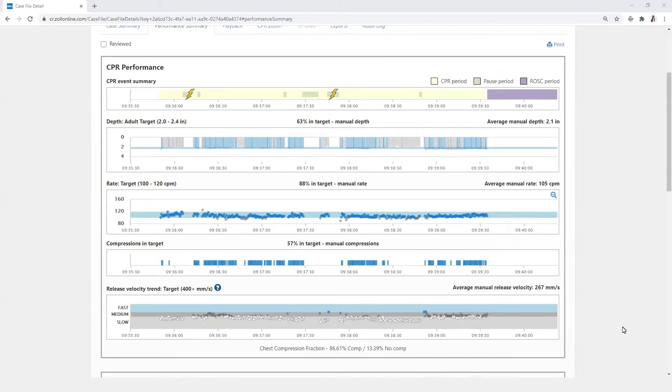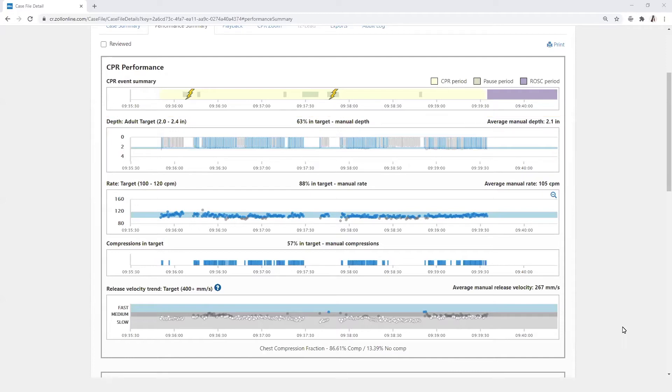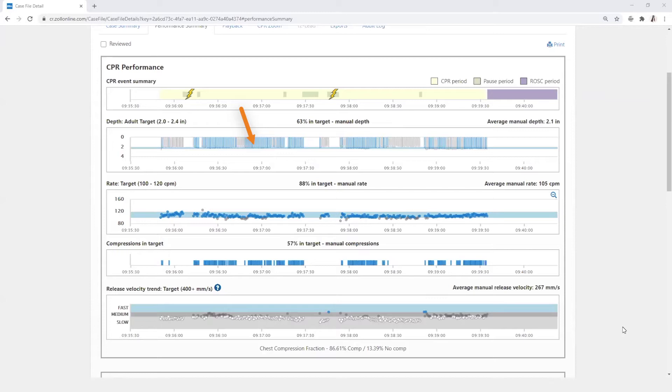Shocks are identified by the lightning bolt symbol. The depth target is specified and can be set to reflect AHA or ERC guidelines. The target is also identified by the blue horizontal line in the graph. Each compression is reflected by a vertical bar.